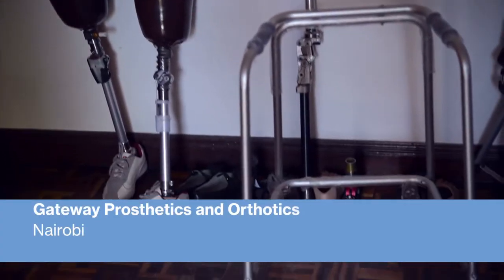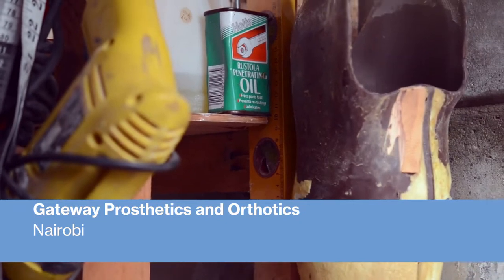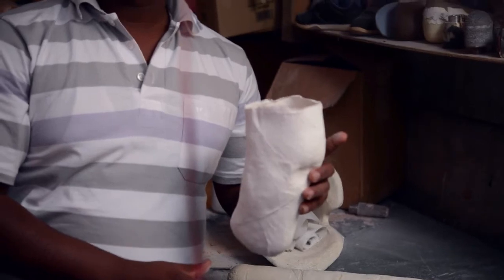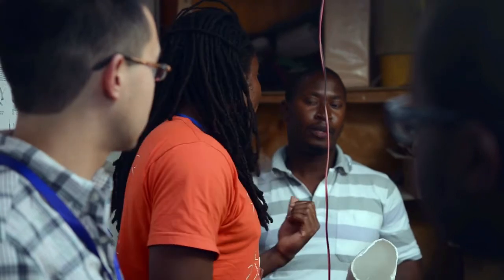My name is Moinina Sengeh, and I'm a PhD student at the MIT Media Lab, where I help design prosthetic sockets for patients with amputations. And we look at how you create interfaces that are more comfortable in a repeatable way, using tools that a prosthetist anywhere around the world can use to allow a patient to live comfortable lives. We'll try to create a mold of that, and then come up with a design that could be multi-material, or that could be based on some other data that we then send back there.